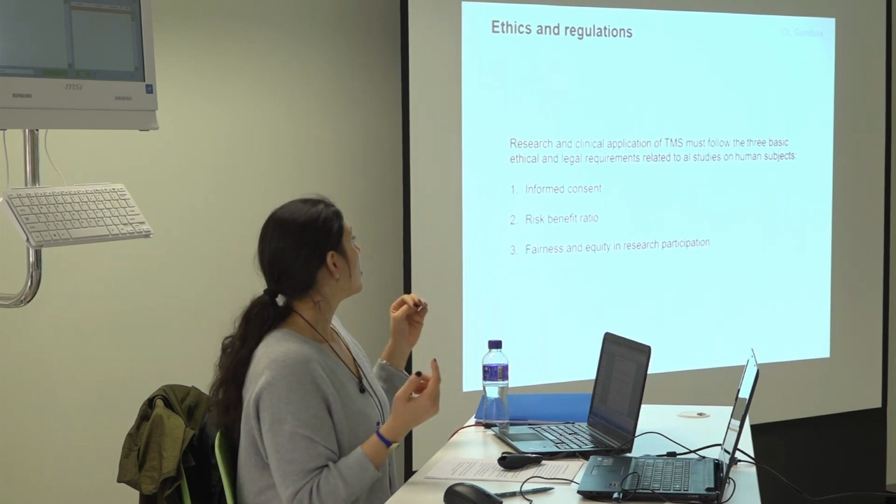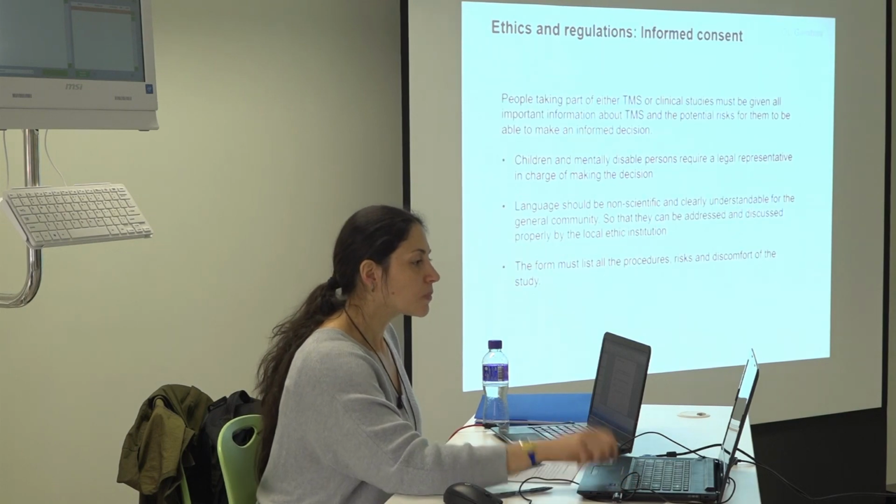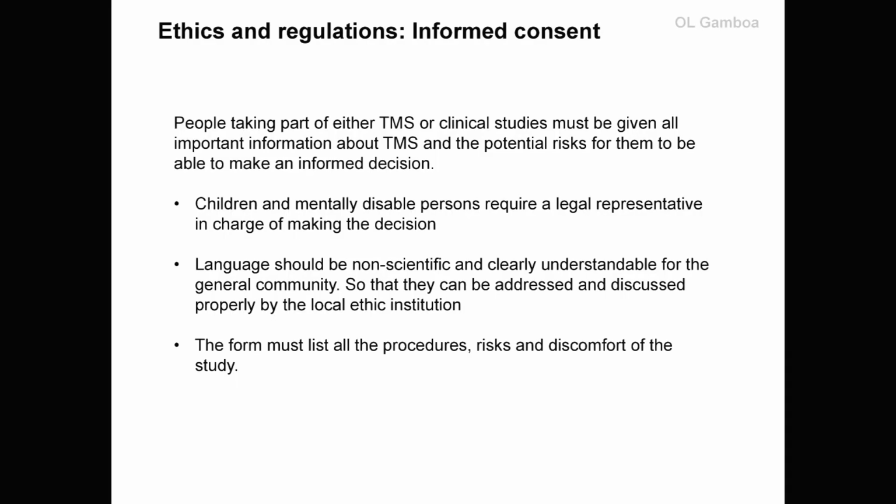And not only what we talk about this. Informed consent. People taking part in the TMS study, clinical or research, need to know about the potential risk, so they are able to make an informed decision.